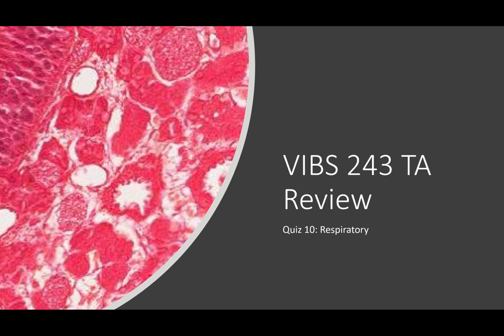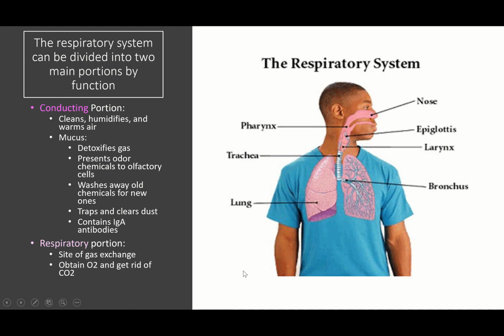This is quiz 10, and this week we are just doing respiratory system. So hopefully this will be a nice little break for you guys. You only have to do one system instead of two this week. But yeah, let's go ahead and get started.